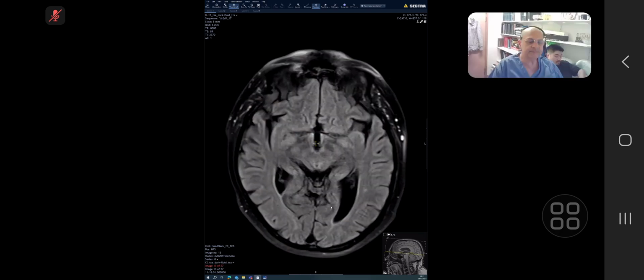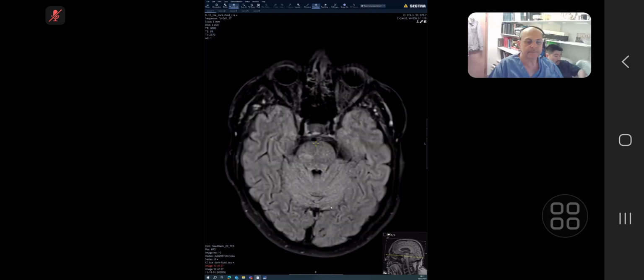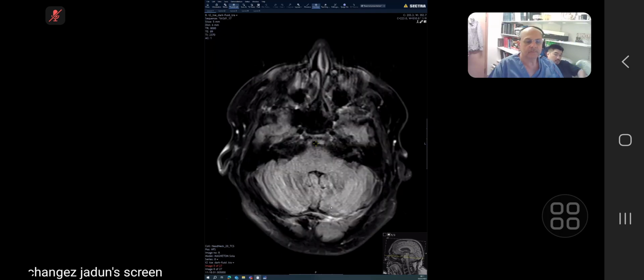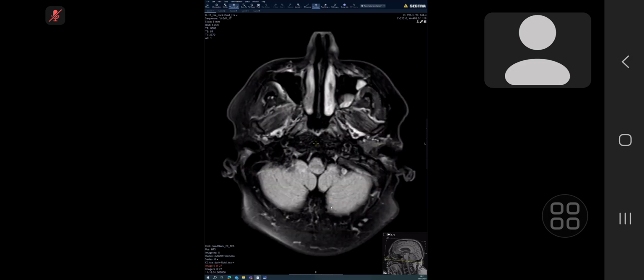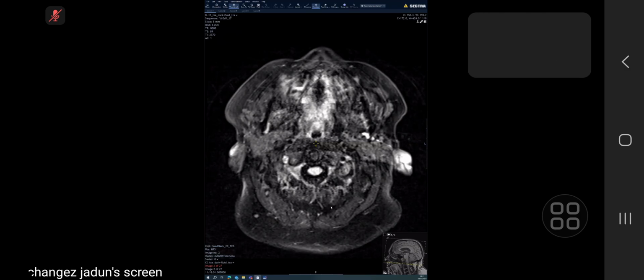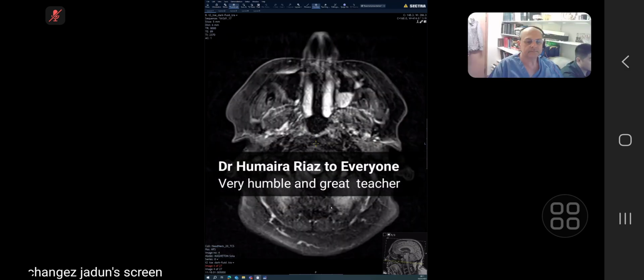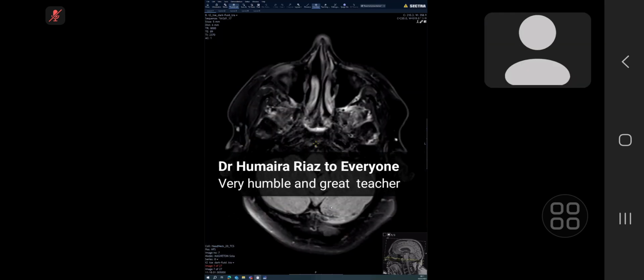Can we go back up again? Yeah, please. The cerebellum looks fine.